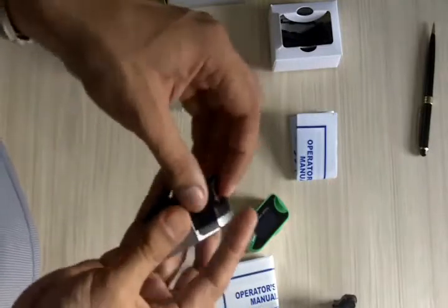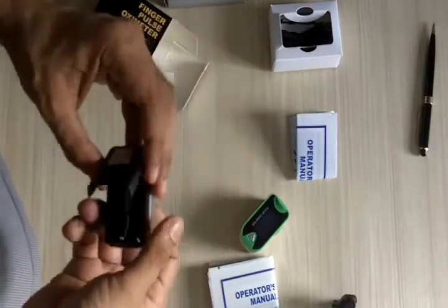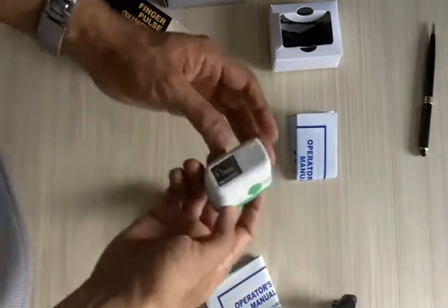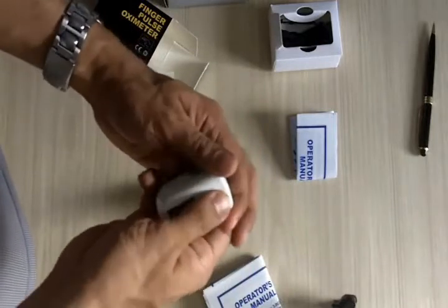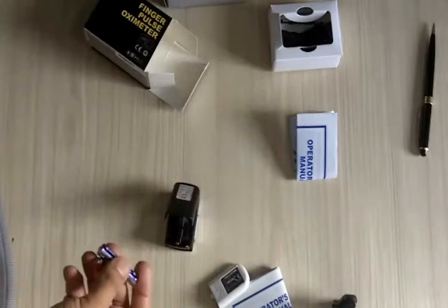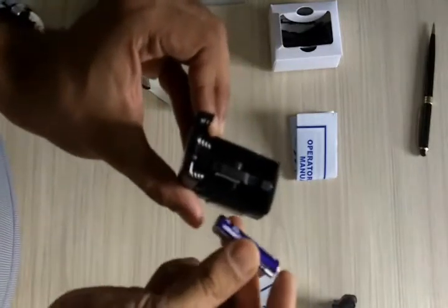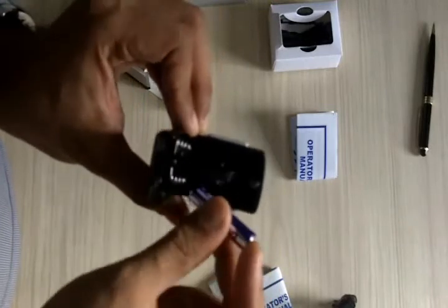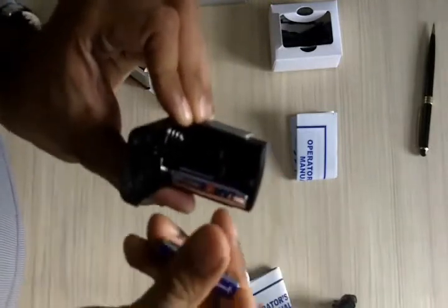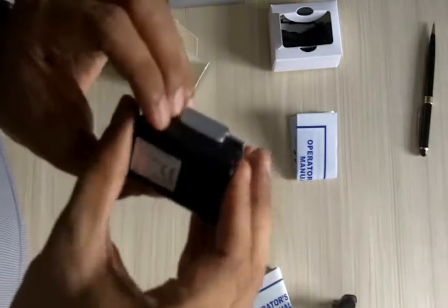Once you've opened the battery cover, you can put the batteries in. There are markings inside showing you how to place them correctly — you really can't go wrong. Close the cover and that's it. Again, the simple thing is that you use this groove to guide your finger in.